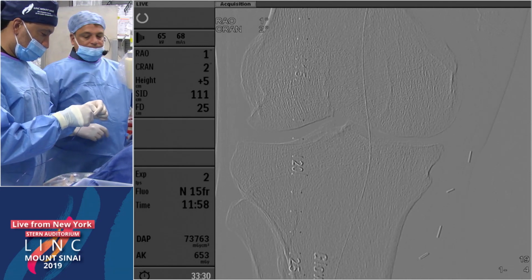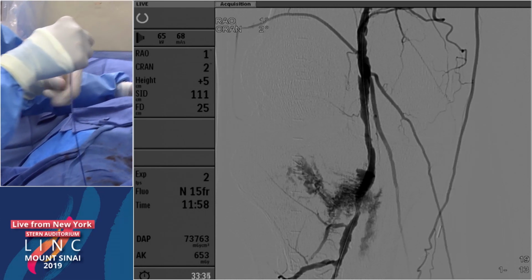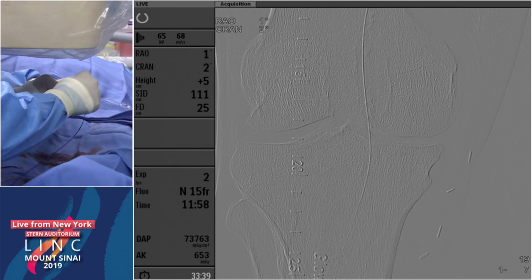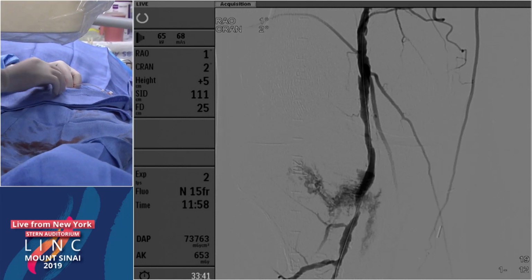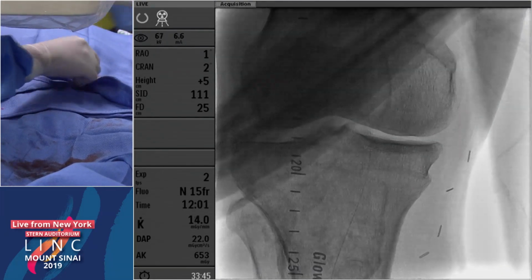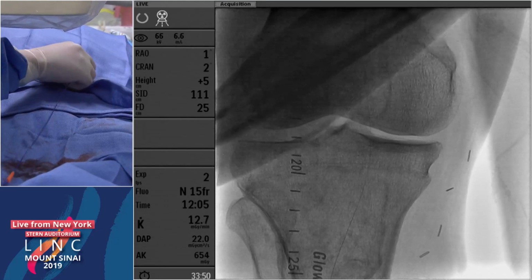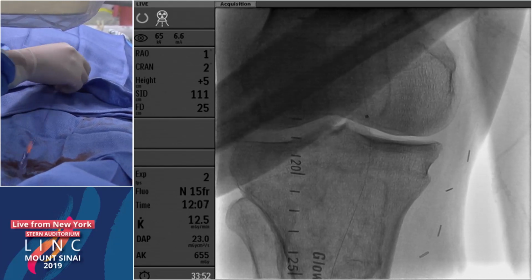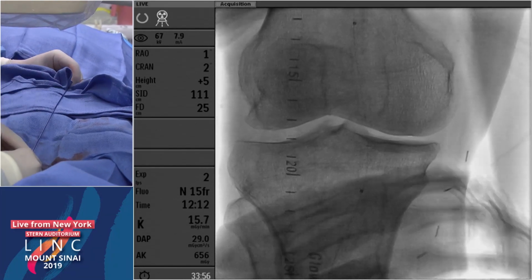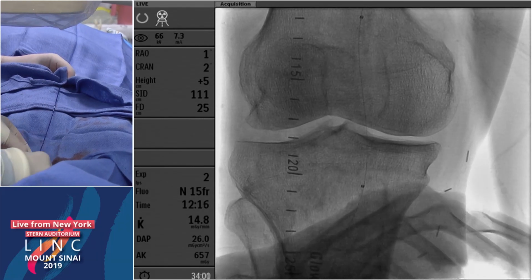PK, this is Fadi. Want to commend you on showing really real life cases here. One of the things that the angiogram also showed, I'm curious about the panel, is the unhealthy nature of the plantar loop. This is a patient that I personally would think about pedal loop reconstruction, especially with this type of wound. Even though, to Stephen, to your point, in terms of long-term patency, it's going to be a challenge. But anecdotally, our experience has been if most patients don't have an intact pedal loop, their healing is challenging.